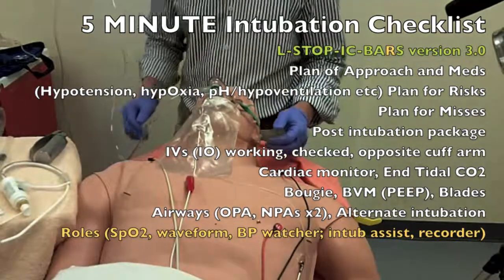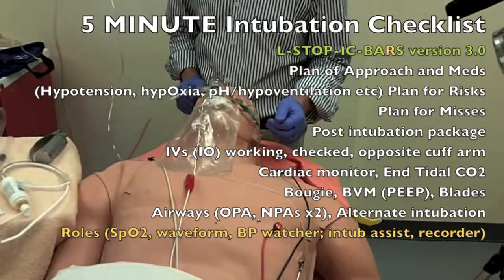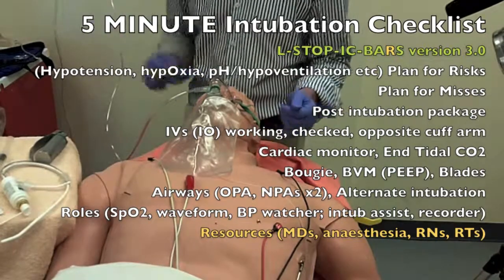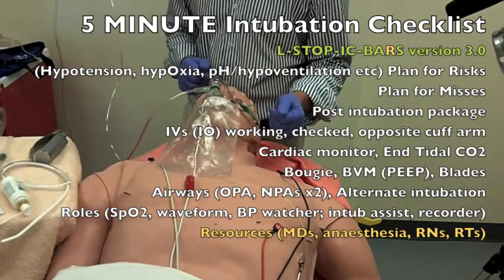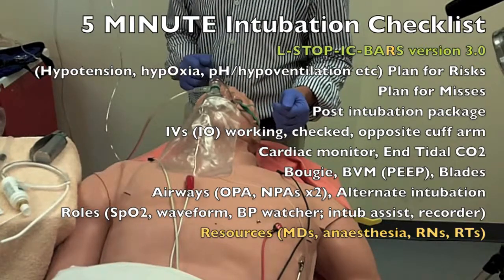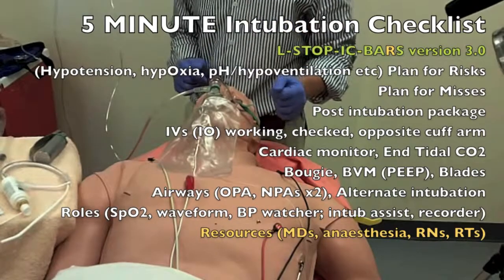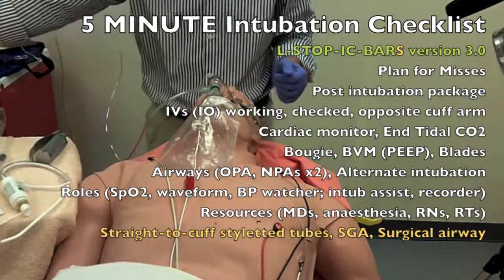And what side do you want me on? Left side or right side? Stay right here. Okay, good. And resources. We've got everybody that we can call in. We don't really have any additional nurses or docs that we can call. So the sats are still doing good, blood pressure is still doing good. Okay, styletted cuffed tubes, dilated tubes. Yeah, we've got that ready.